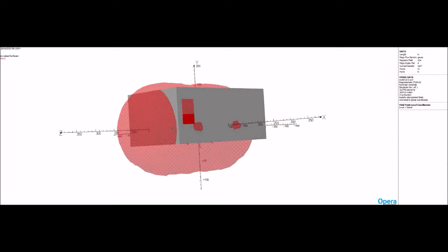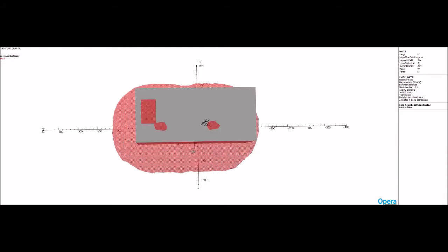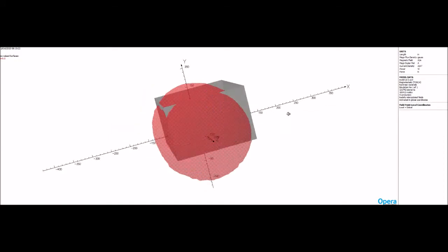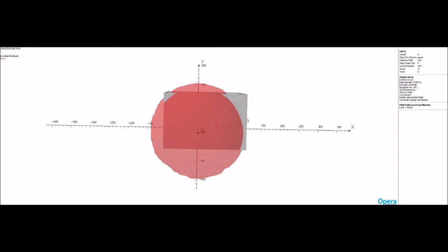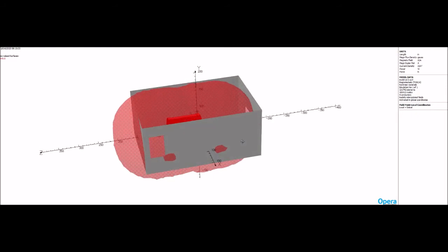The reason we wanted to show you this is that it also comes underneath. And so what you're going to see is when we add steel, for instance, on the back wall, that 5 Gauss is going to continue to try to come underneath that back wall and also on top, because it's a spherical field, and so it goes out equally all the way around, kind of like an oval. So I'm going to add some steel and show you how this works.